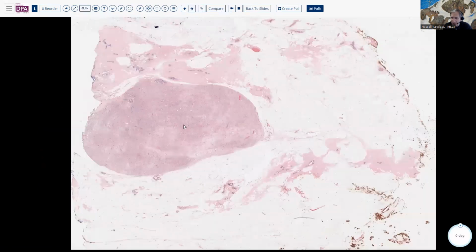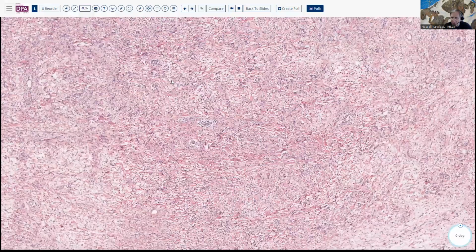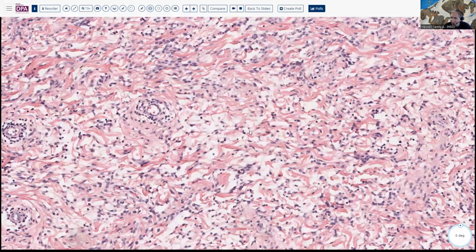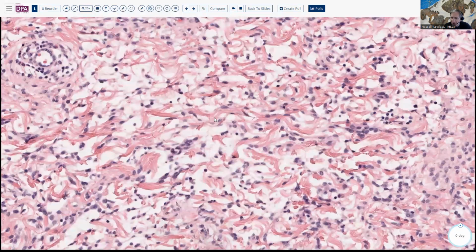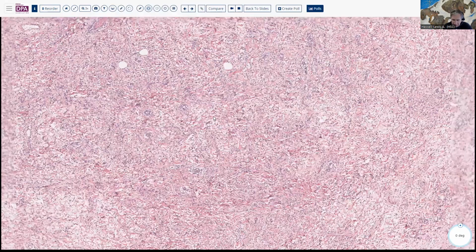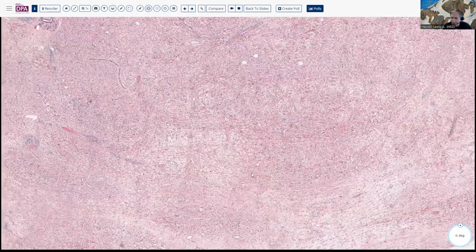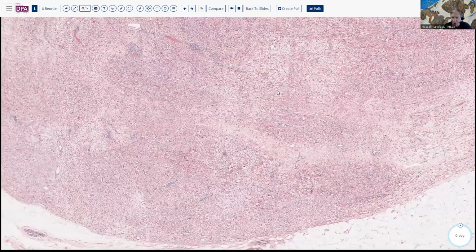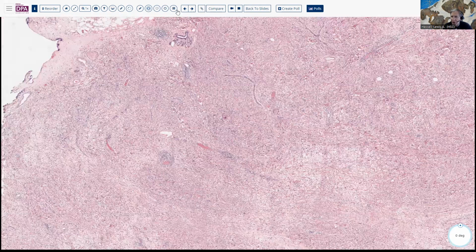As expected, this lesion has a myofibroblastic immunophenotype with a mixture of myoid markers, and here you can see this nice collagenous background to this lesion. So these cells may stain with myoid markers like smooth muscle actin or muscle-specific actin, generally not with desmin or caldesmon that would be characteristic of smooth muscle markers.